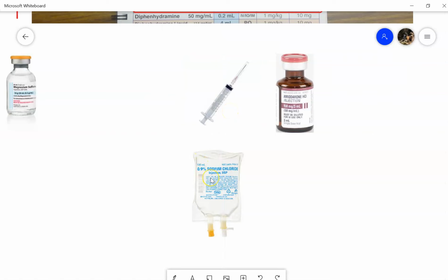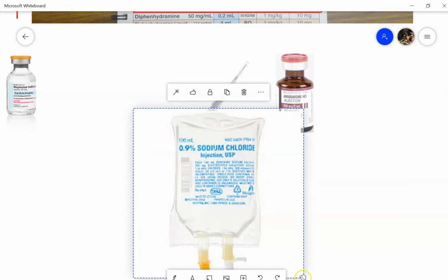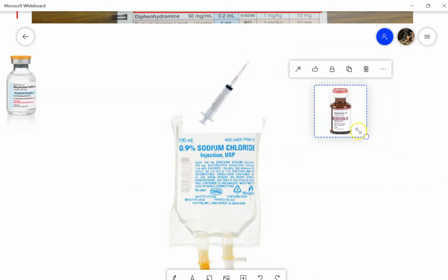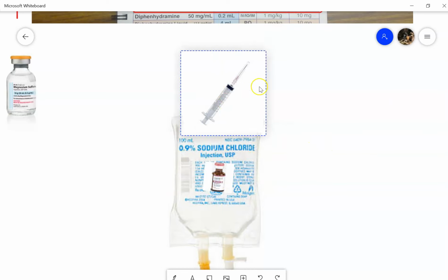If you think that's kind of cumbersome and it's going to really be hard to count out your 10 minutes while you're doing that, you can also employ the IV pump to help you do that. And to do that, what we're going to do is we're going to take this 150 of amiodarone, and we're going to put the full dose of that into our 100 bag, all right?